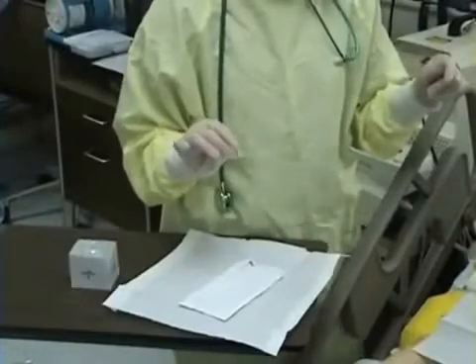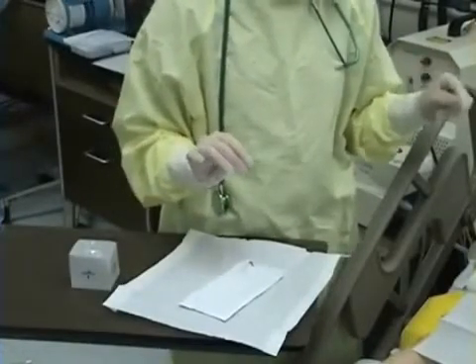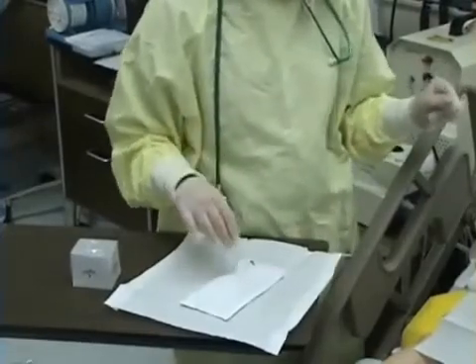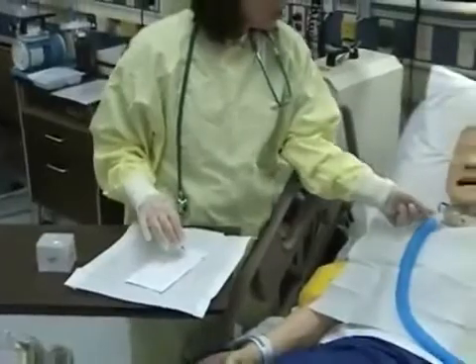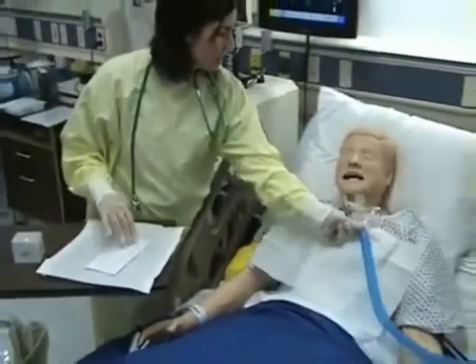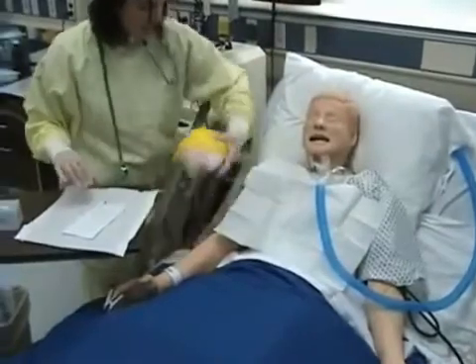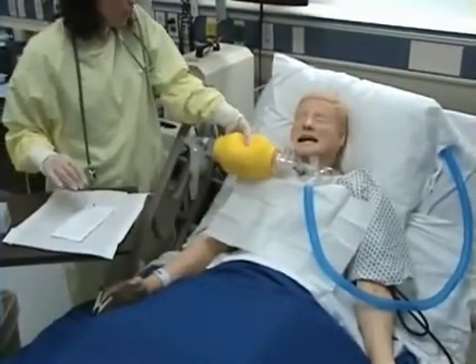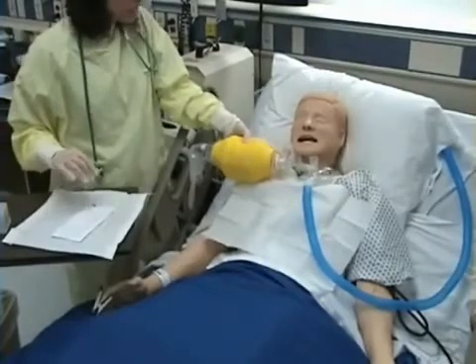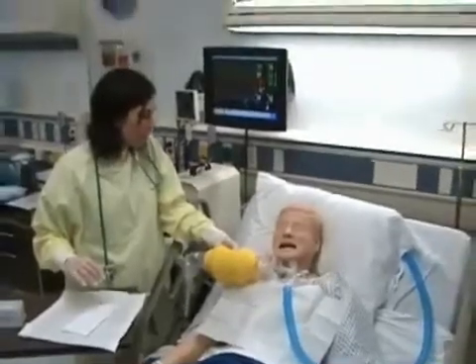Before I suction my patient, I am going to give them some oxygen to increase their oxygenation. So I will begin by, with my non-dominant hand, moving their trach collar to the side, taking my ambu bag, attaching it to the trach, and giving approximately 3 to 6 breaths, monitoring my patient's oxygen pulse oximetry.